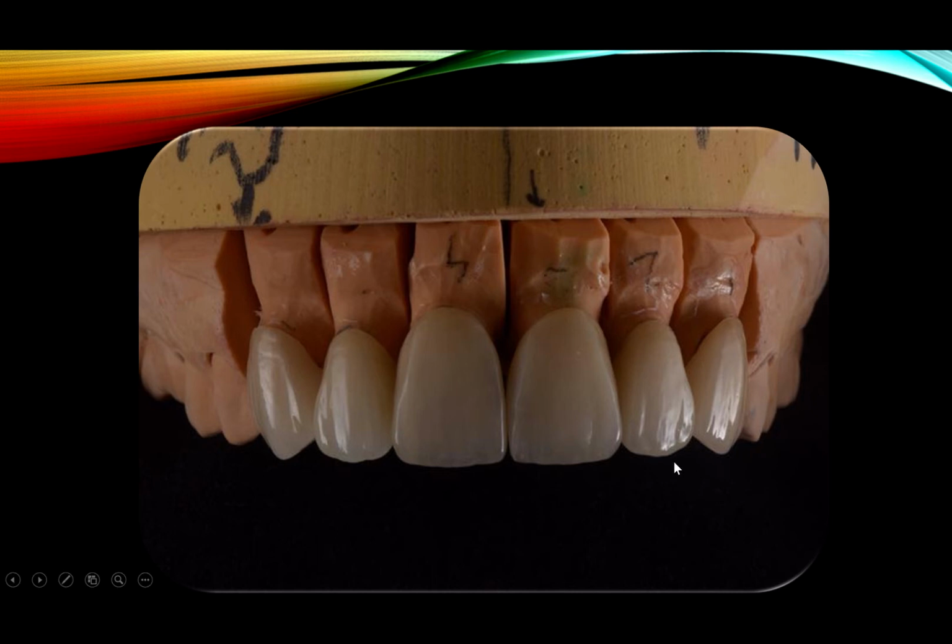But lithium disilicate, you can chop it off, but still I use aqua finisher, and water is always there. Get the shape that you want, and even if you want to cut back here or there, or you see that you need enamel here, or deep dentine here, or cervical with deep dentine, or you need opals and there is no space for opals, cut it back and do your opals, no problem.